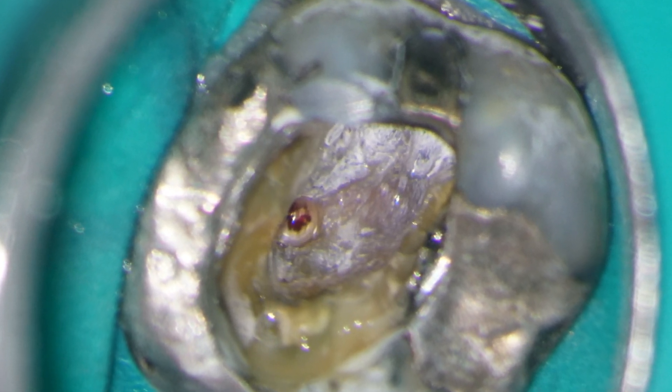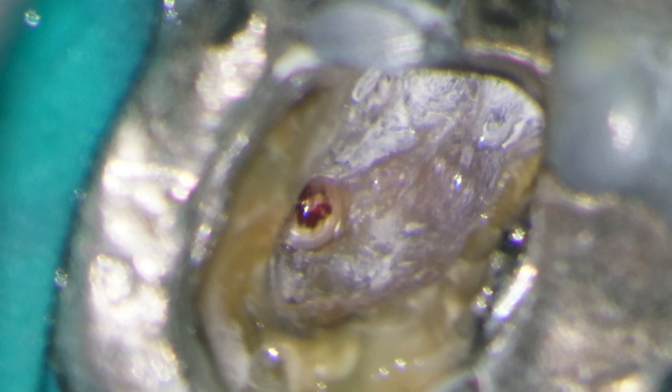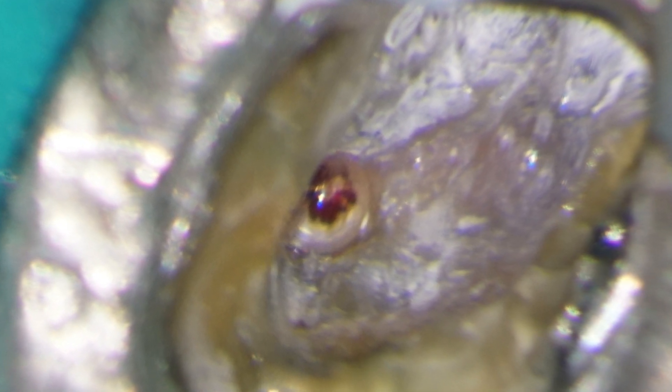Zooming in now on the floor of the pulp chamber, you can see the perforation quite clearly. Next, I'm using a large LN burr to carefully remove the remains of the roof of the pulp chamber and expose the orifices of the buccal canals.